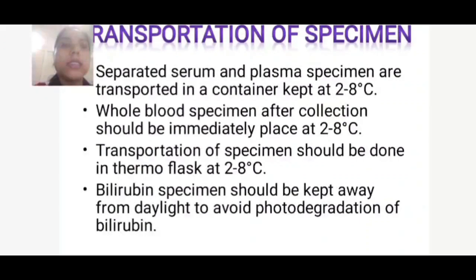Now there is the transportation of specimen. For transportation, separated serum and plasma specimens are transported in a container kept at 2 to 8 degrees Celsius. Whole blood specimen after collection should be immediately placed at 2 to 8 degrees Celsius. Transportation of specimen should be done in a thermoflask at 2 to 8 degrees Celsius. Bilirubin specimen should be kept away from daylight to avoid photo degradation of bilirubin.